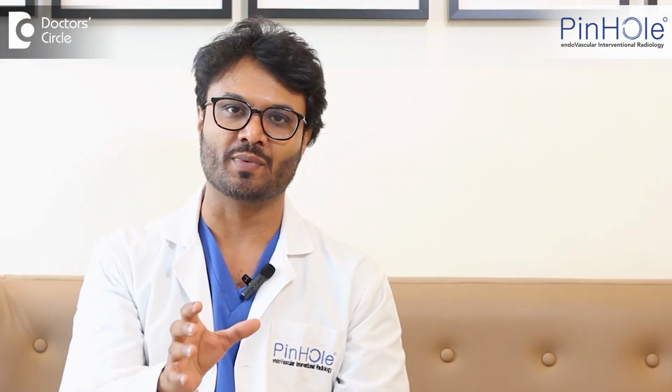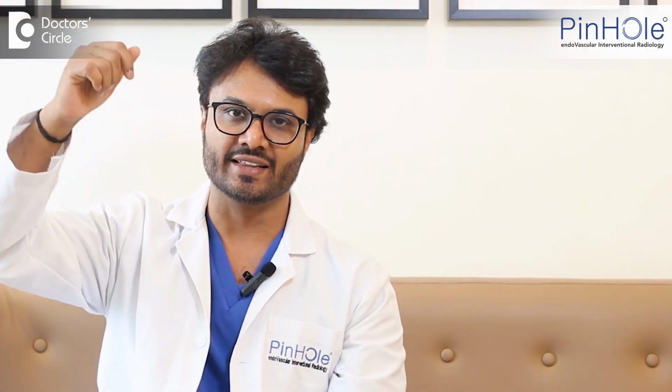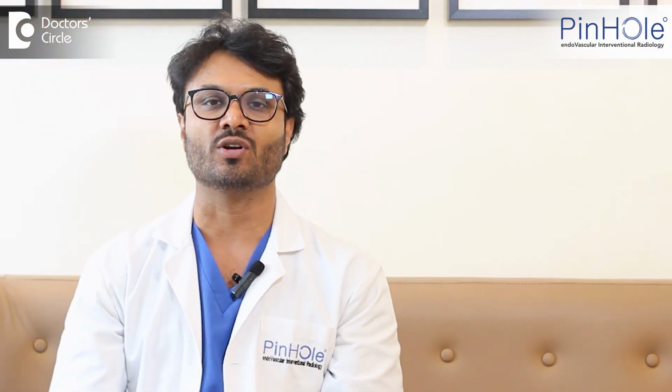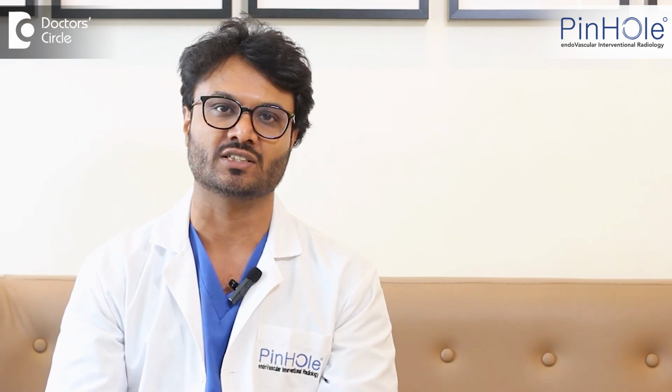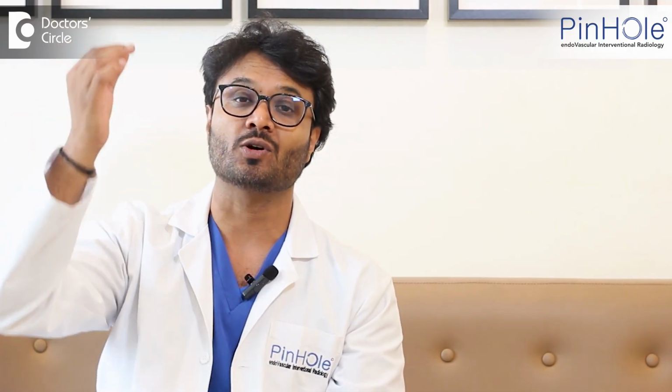Now, how we do an ultrasound, we put the probe on the patient, then I can see the lesion maybe 4 centimeters, 5 or 6 centimeters deep from the skin, and this lesion is seen, identified, and the target area is documented. After this, we pass a thin needle to give local anesthesia in your skin and then pass the biopsy needle deep under the guidance, making sure that we do not come into contact with any major blood vessels or structures on its way, get to the lesion and take multiple cores.